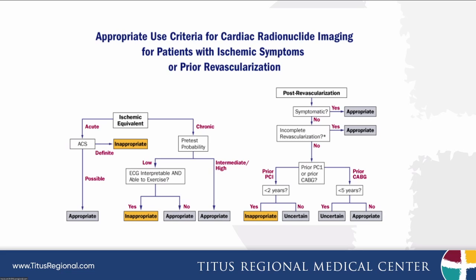after pharmacologic stress. Or if they have a specific incidence where they've had previous bypass surgery or previous stent placement, then nuclear imaging is going to be a superior mode to look at them for stress testing in order to see if they have residual areas of ischemia. The reason it's superior is it can more directly localize where the ischemia is. We can see if it's in an area where they've had a previous stent, or if it's a different area of the heart. We can see whether it's an area they've had a previous bypass.